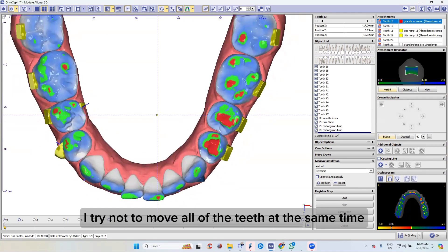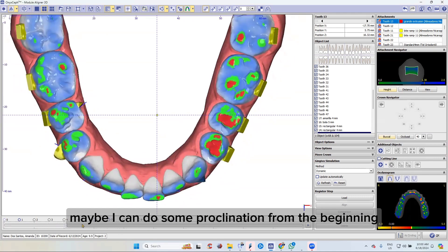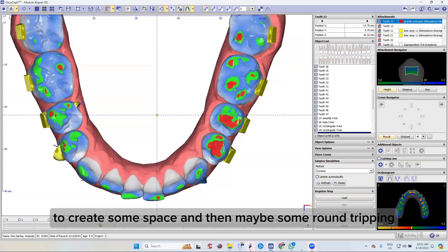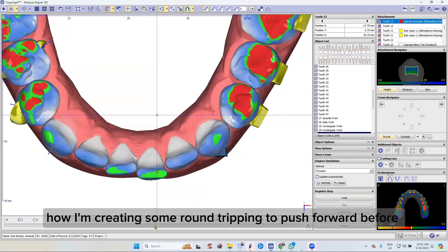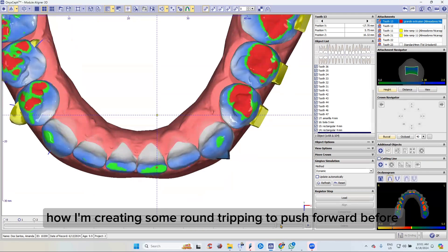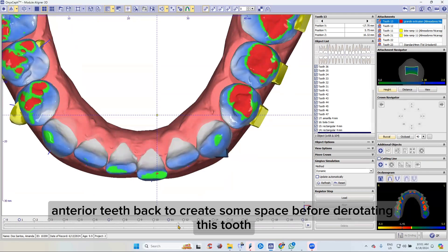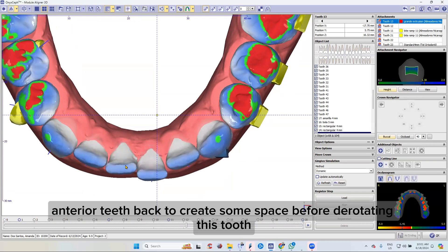Maybe I can do some proclination from the beginning of the anterior teeth to create some space, and then maybe some round tripping. As you can see on this tooth, I'm creating some round tripping to push forward before bringing the anterior teeth back to create some space before derotating this tooth.